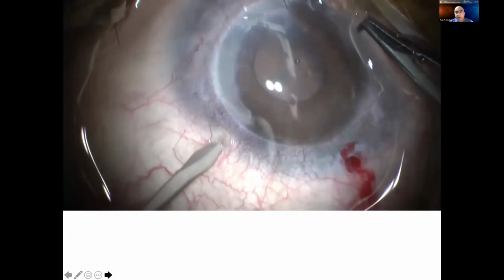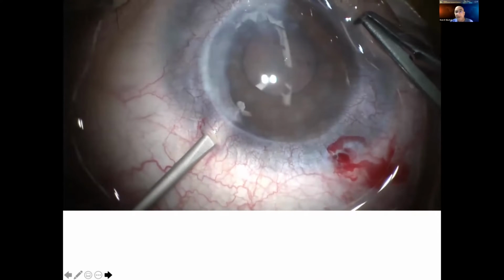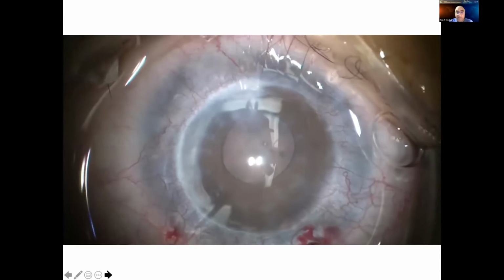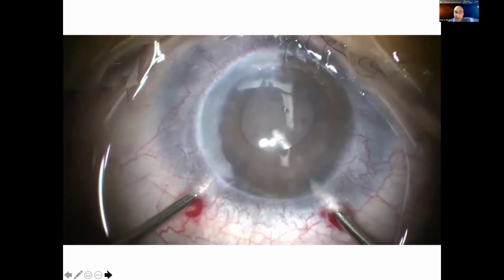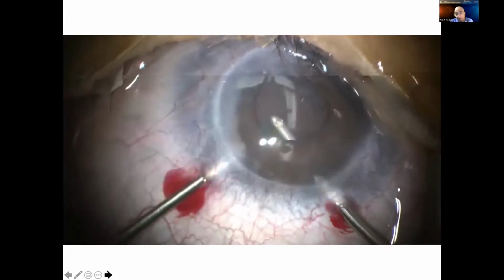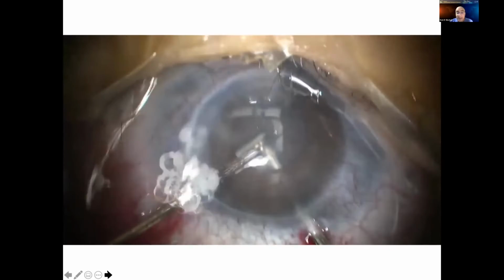So the first thing is I'm going paralimbal, and in this case, I have some peripheral iridectomies, which is part of my PKP technique to prevent secondary glaucoma, and I am inside the bag, okay? That's the important thing. And I've made my second stab, and now I put my irrigation aspiration into the bag. The height of my irrigation bottle must be low, because you don't want to expand the capsule and the openings that you've made be ripped open. So I'm going into the lens, and I am underneath the anterior capsule, underneath the anterior capsule.